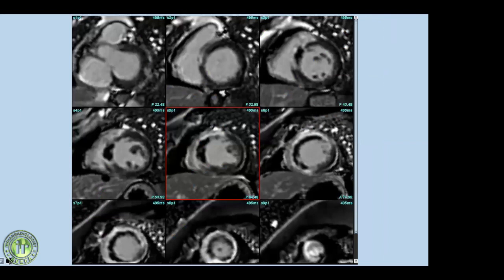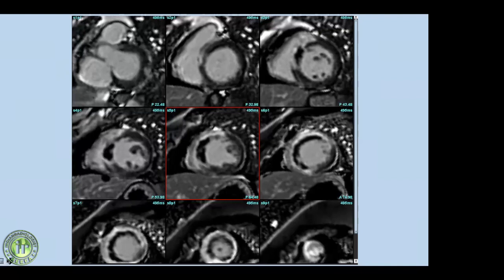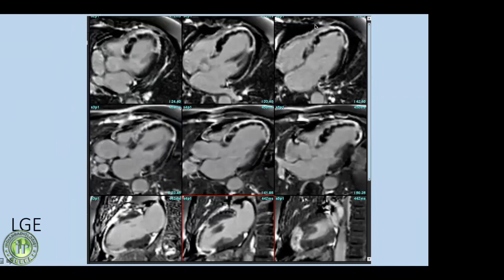The most crucial set of images in cardiac MRI is late gadolinium enhancement images. There is a transmural scar involving the anterior wall, interventricular septum, and all apical segments. Within this scar are dark areas — these are microvascular obstructions. When the microvasculature of the myocardium is destroyed, this is termed the no-reflow phenomenon: no gadolinium reaches those areas, so they remain dark. The entire anterior wall and all apical segments in the LAD territory are completely scarred with large areas of MVO.